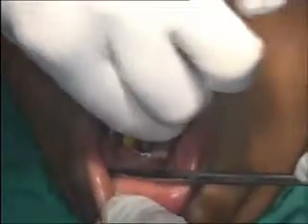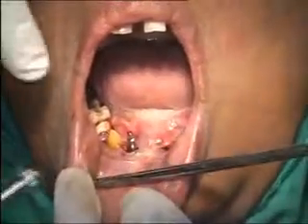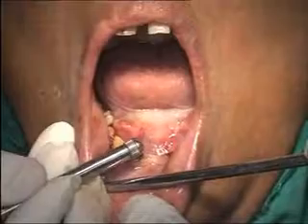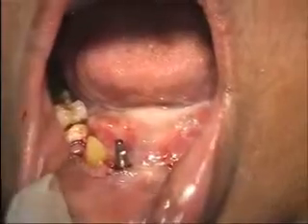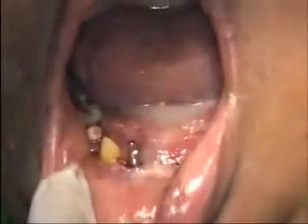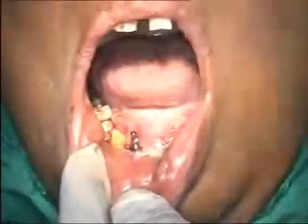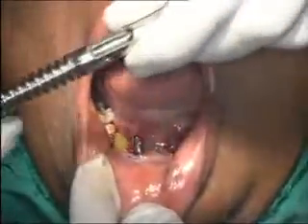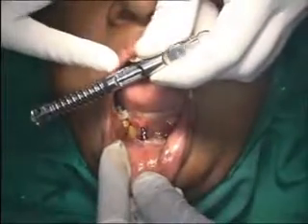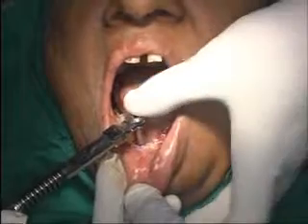Now, if I have tall height, I can always cut this with a cross-cut carbide bur. How to measure whether I have got 40 Ncm torque? We have a torque ratchet which is calibrated. Again it is in and out, facing towards you. It has got markings: 20, 40, 60, infinity. If I do this, can you see that the ratchet is breaking here?